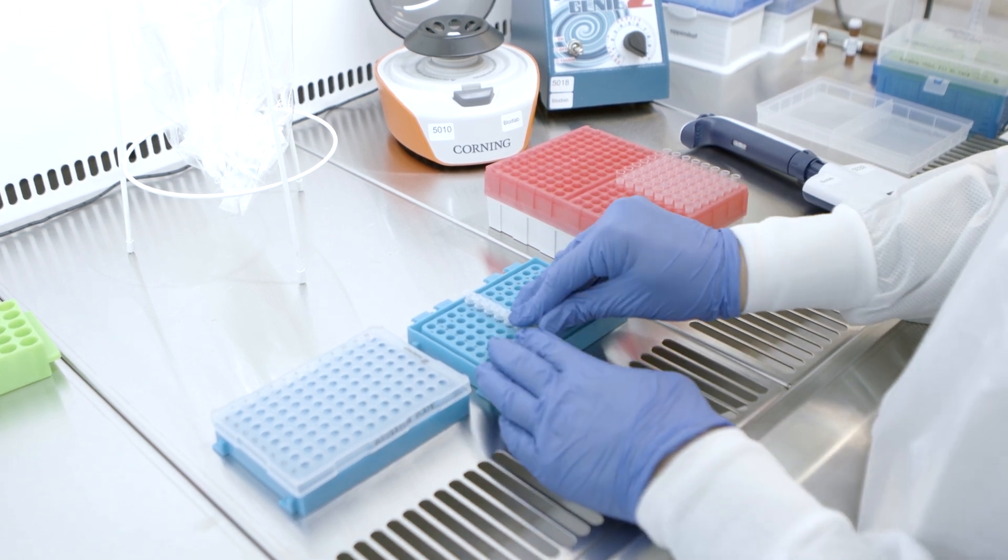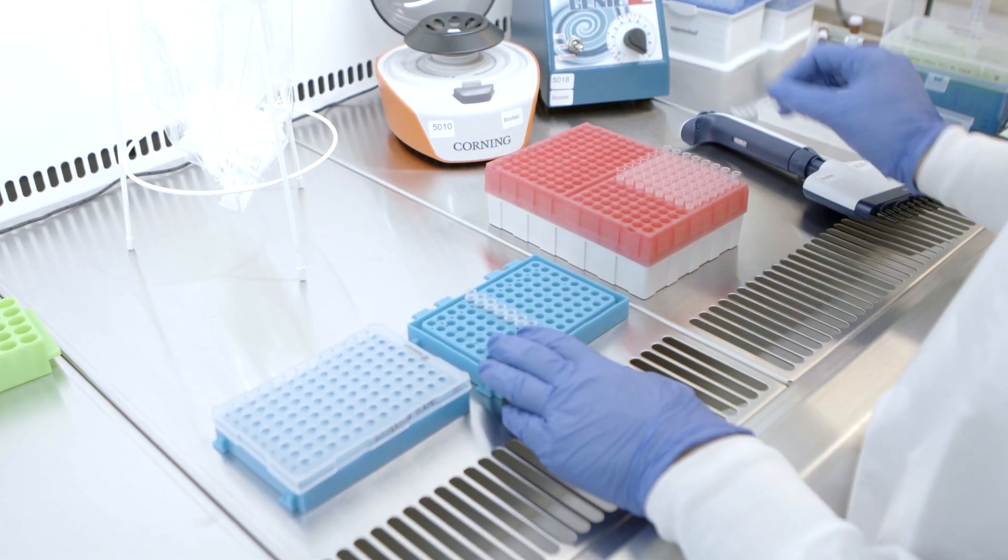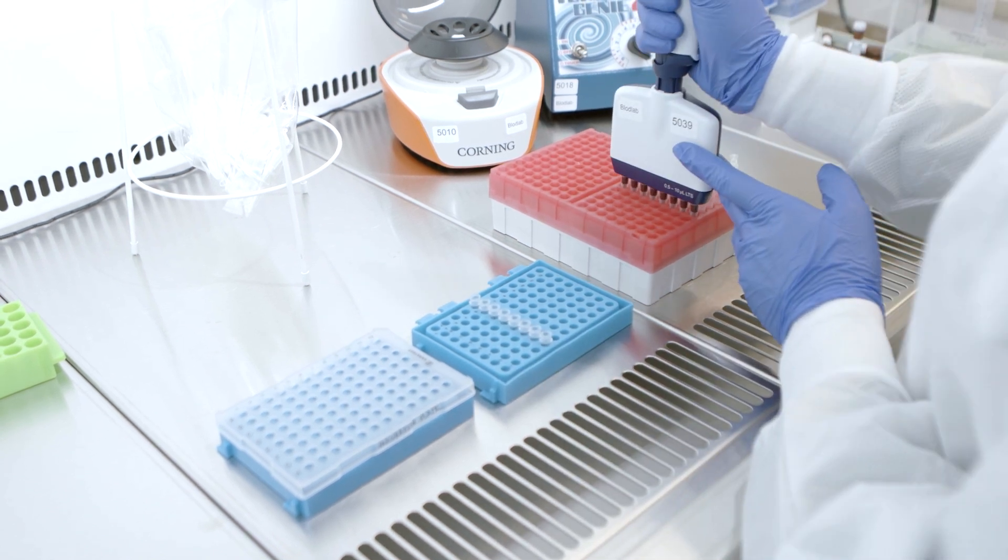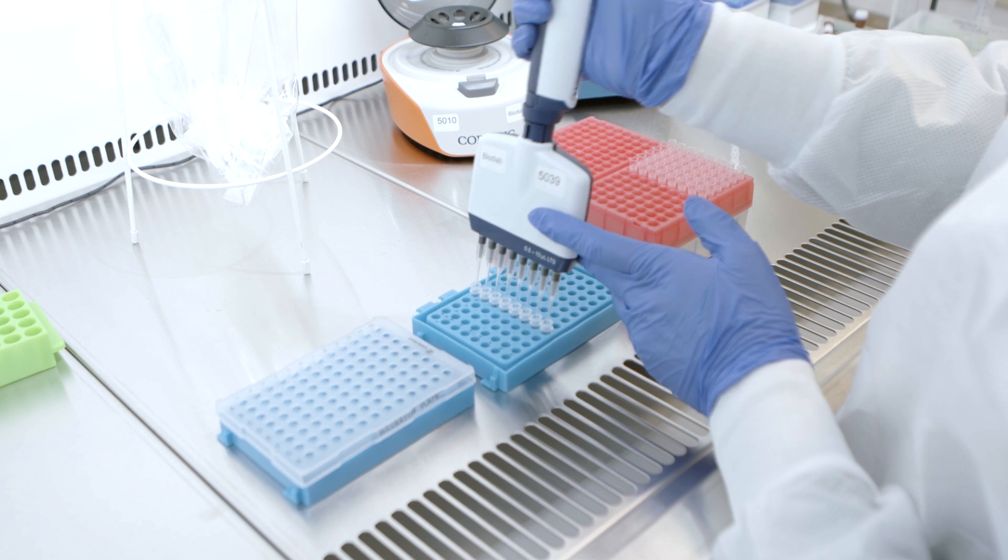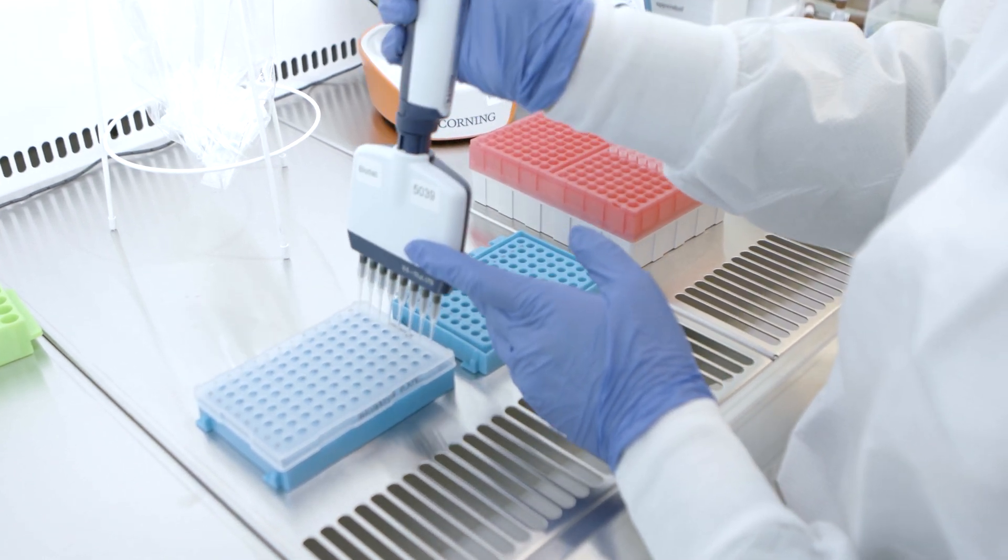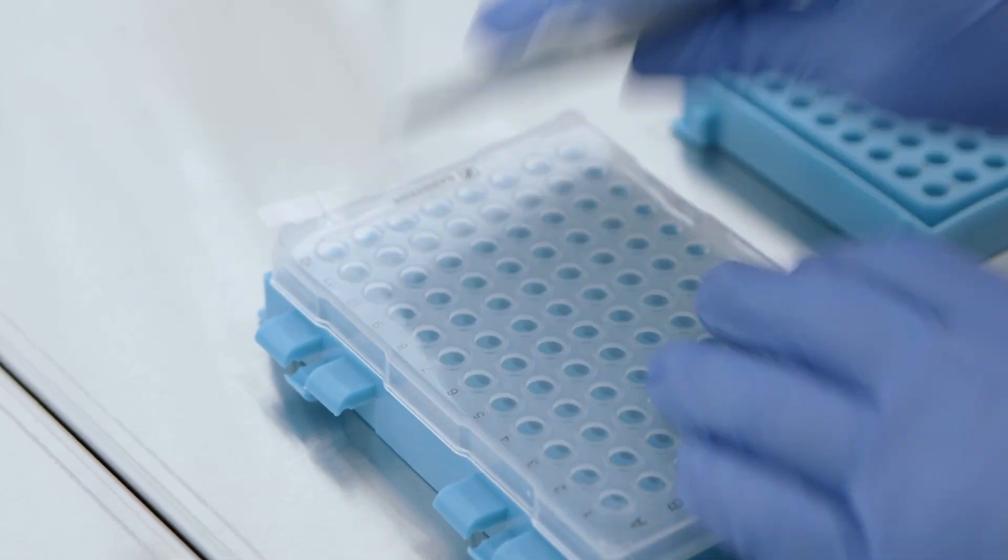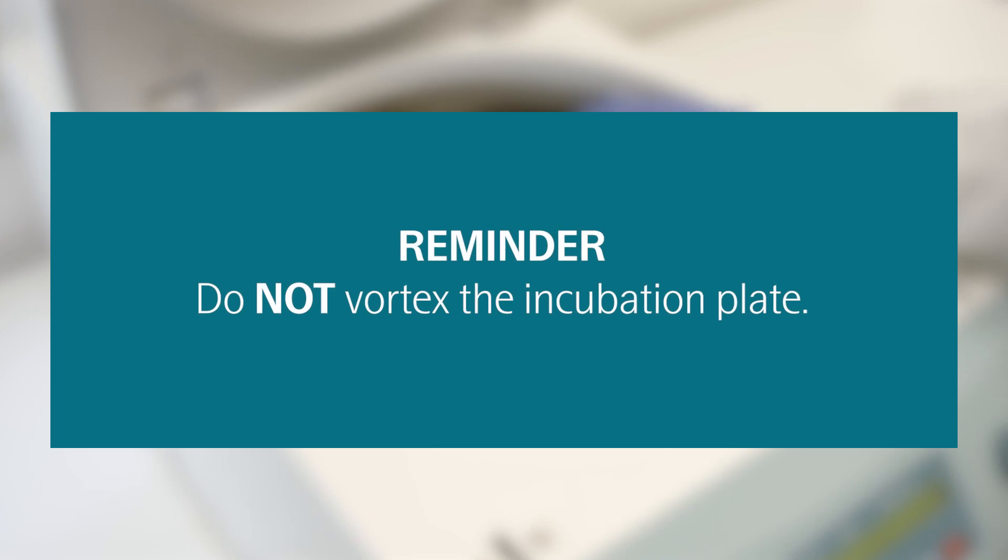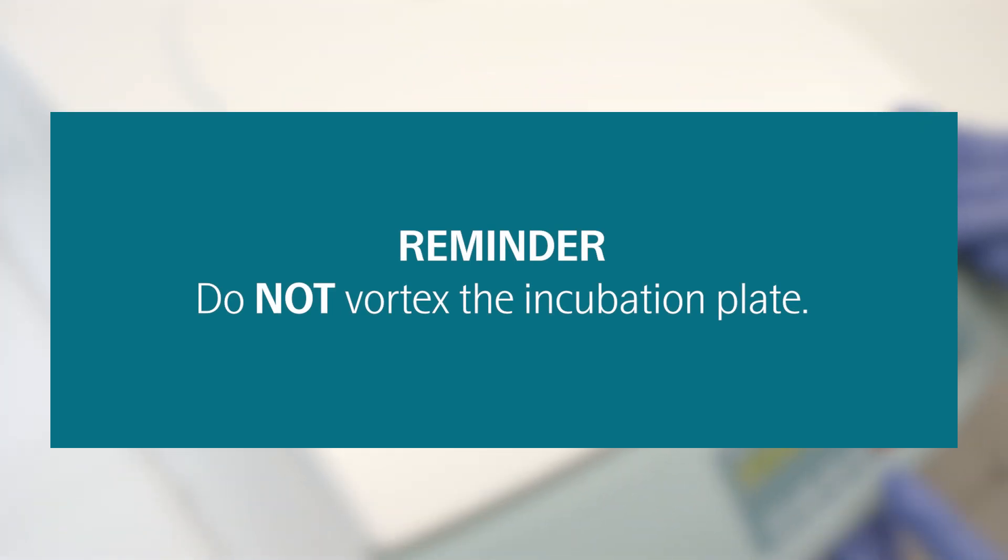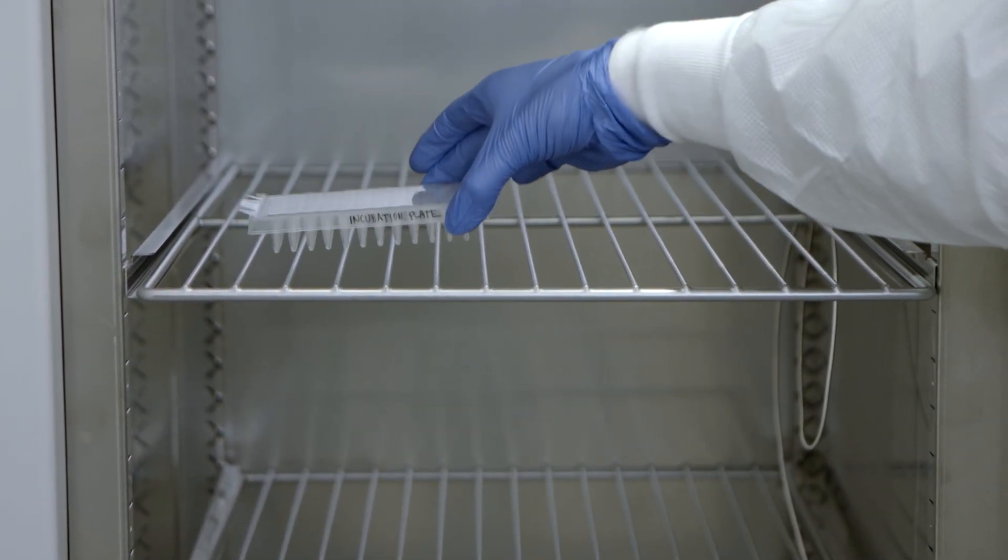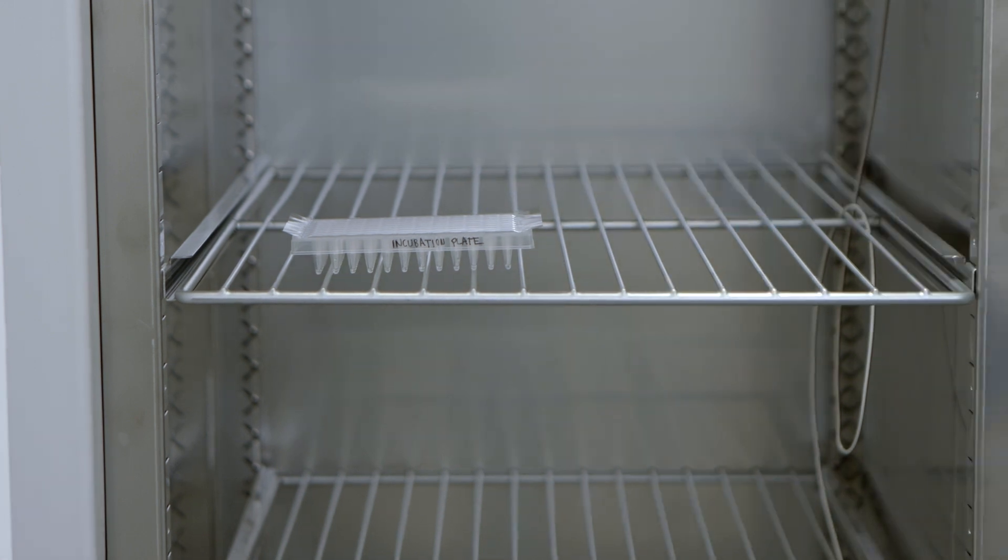Finally, use the multichannel pipette to transfer 1 microliter of negative control and interplate control from the prepared PCR control strip into the wells of column 12 of the incubation plate using forward pipetting. Seal the plate thoroughly with an adhesive plastic film and spin down. Incubate at plus 4 degrees Celsius for 16 to 22 hours.